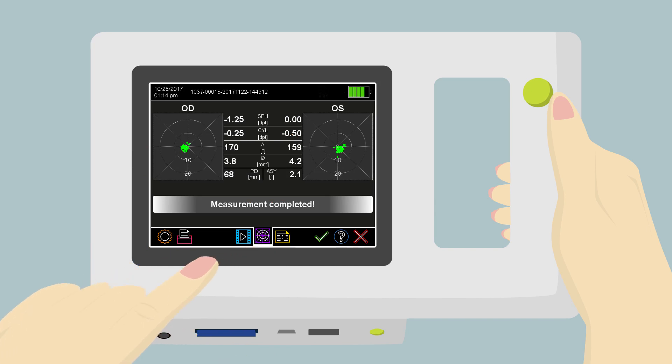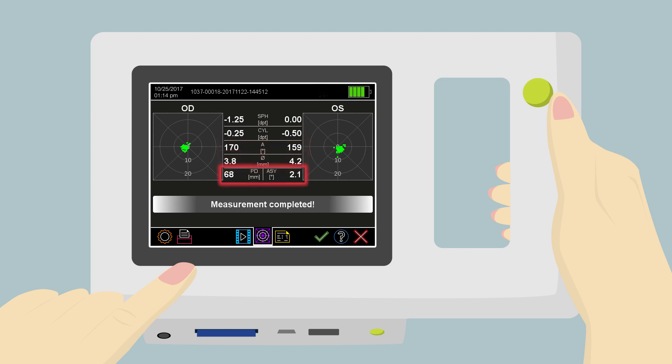Displayed in the measurement values is the Sphere, Cylinder, Axis, Pupil Diameter, Pupil Distance, and Gaze Asymmetry. These measurement values are also reported on all printouts and in the patient database.